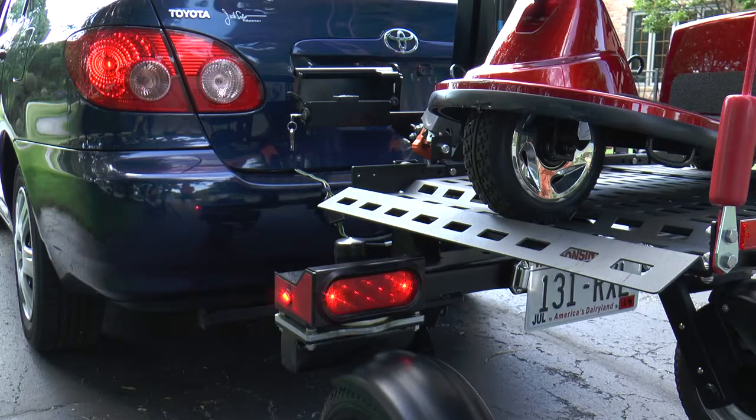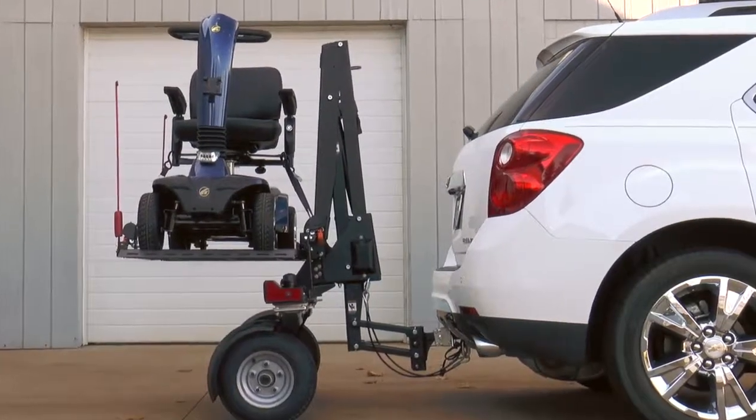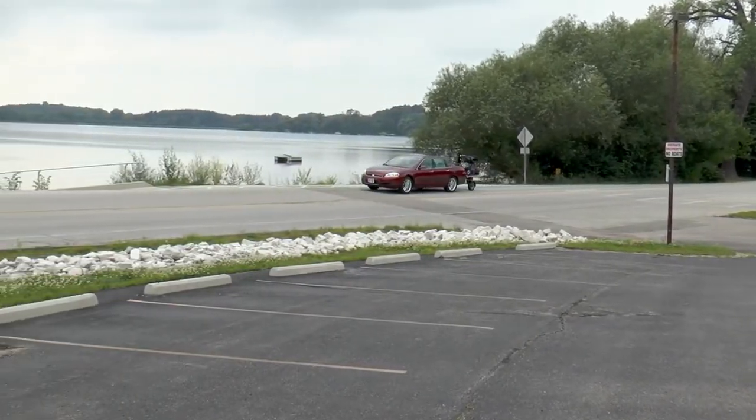Safety tested in all types of weather and driving conditions, the Chariot also comes standard with a lighting package including running and brake lights, turn signals, and a lighted license plate. Connected by a frame-mounted hitch, Bruno's Chariot can be used on select cars, SUVs, crossovers, and minivans.